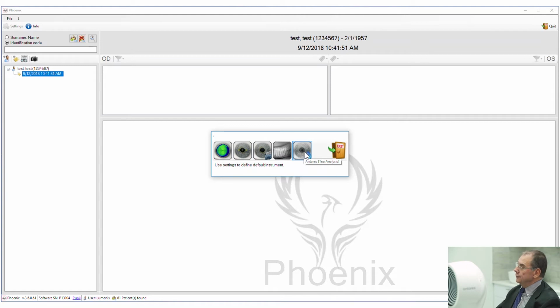This is a non-invasive breakup time analysis. It's done fully computerized and is very easy to do and very repeatable. It's objective. Nobody's taking part in it, so we have a very reliable result with this. We can always escape if we don't want to do something.